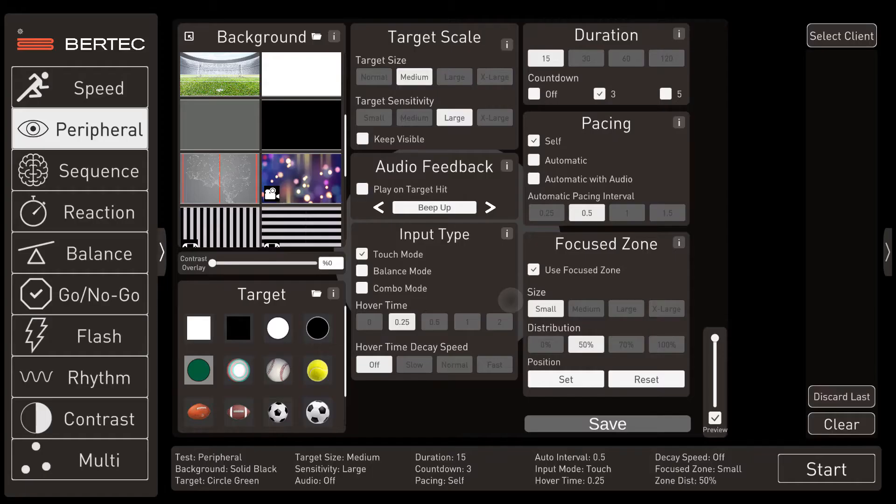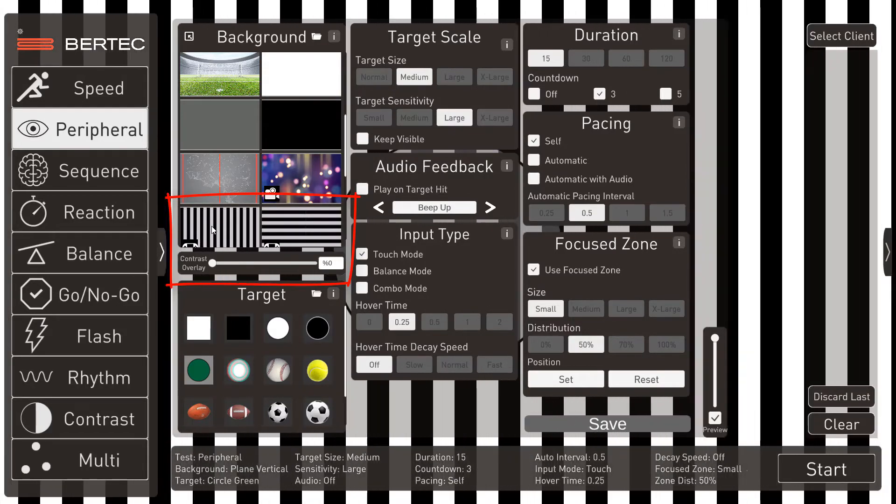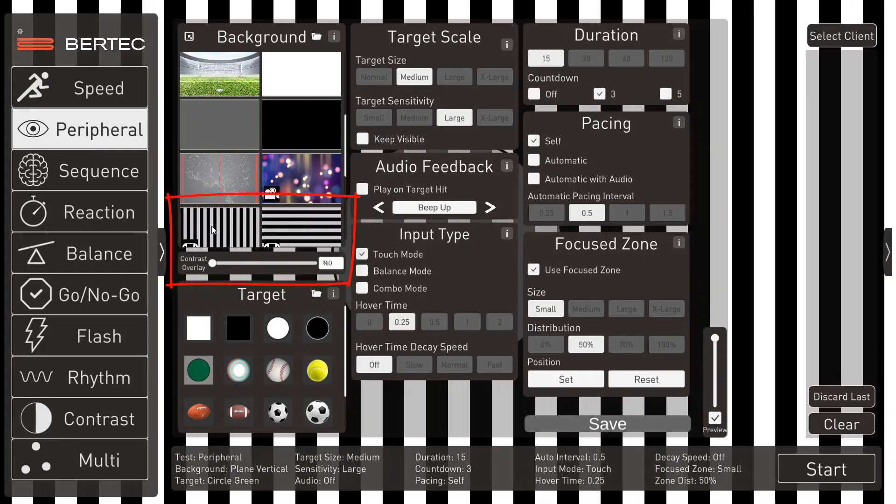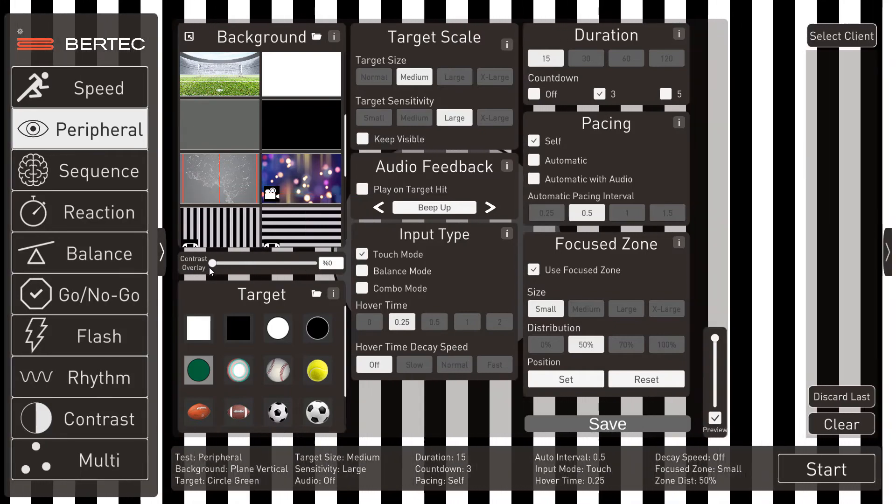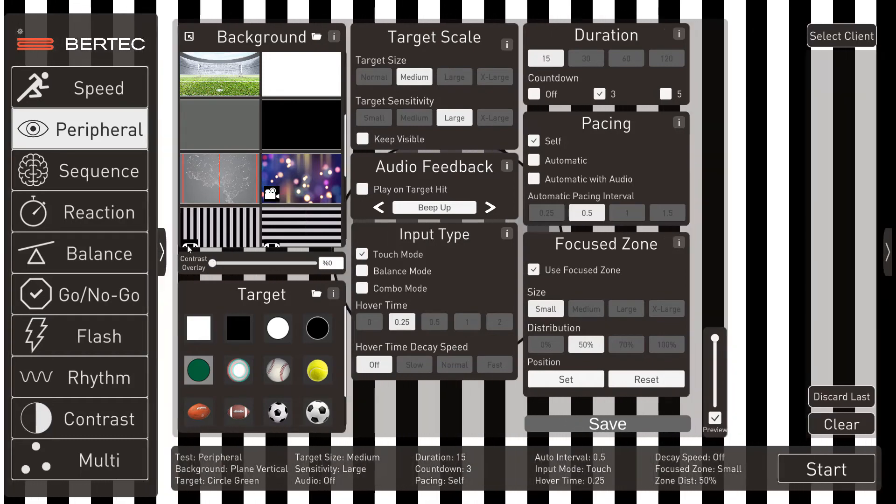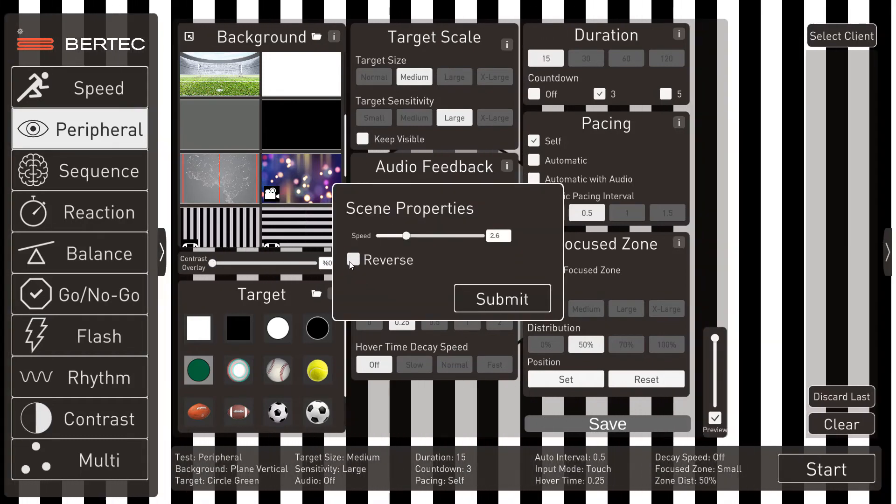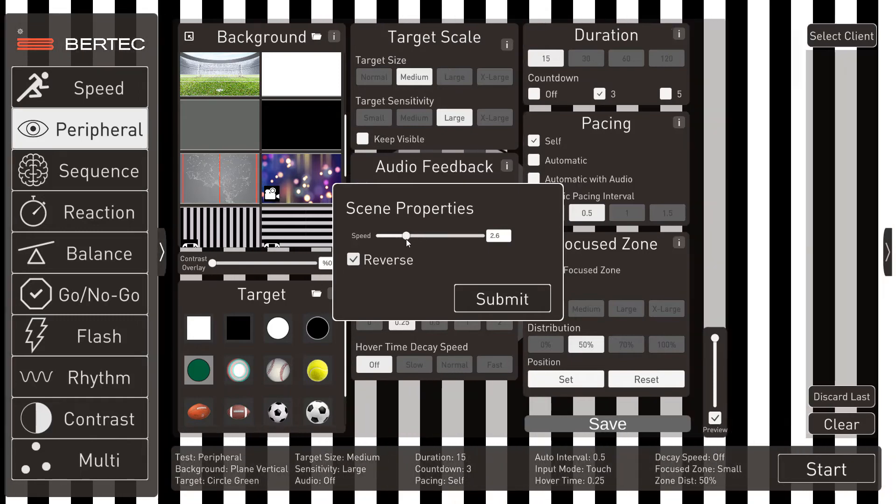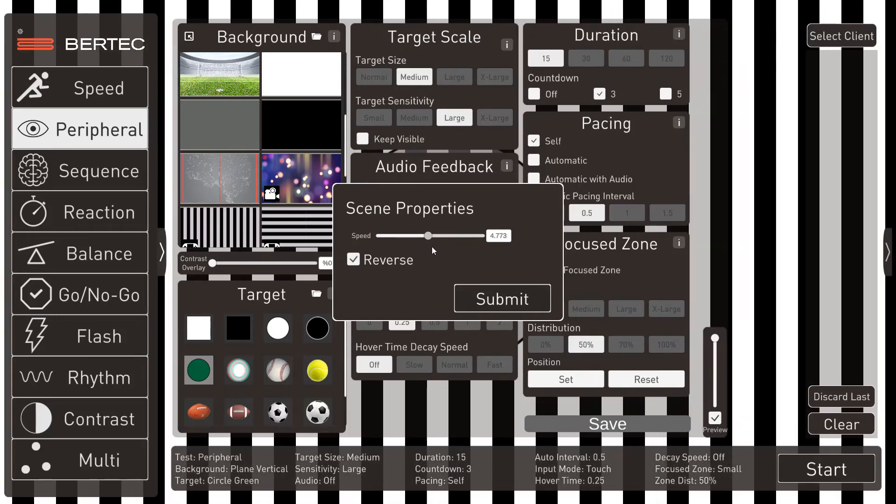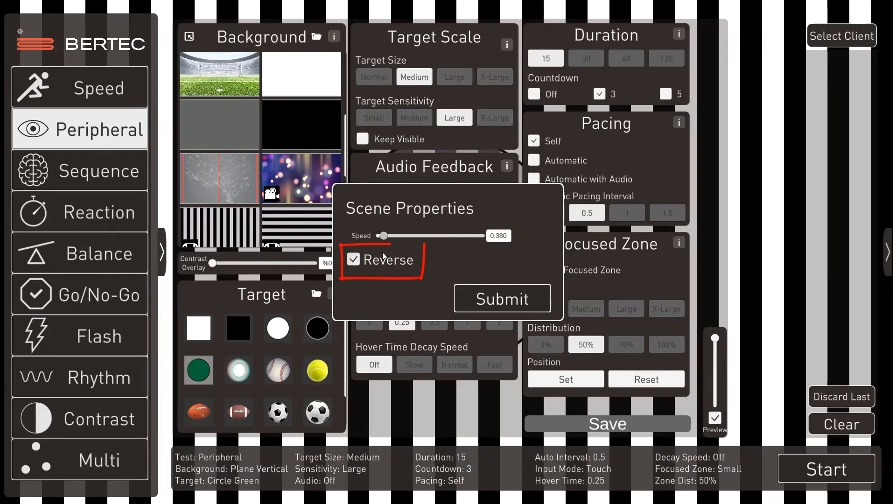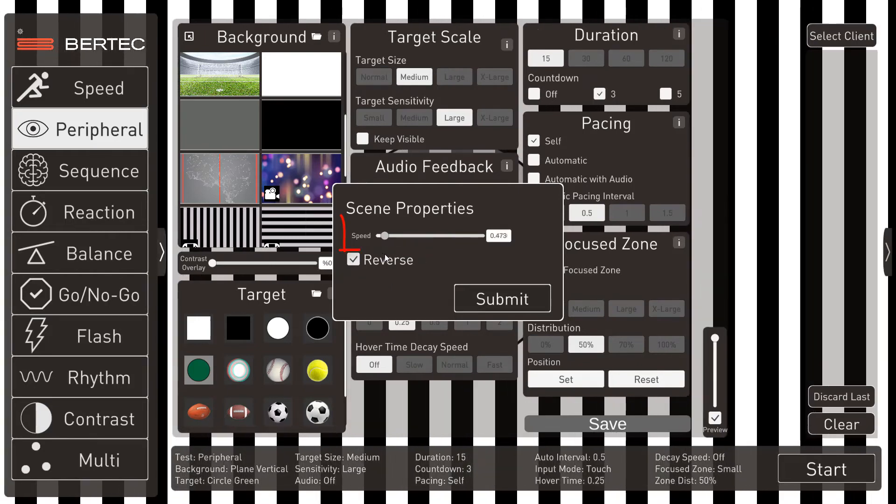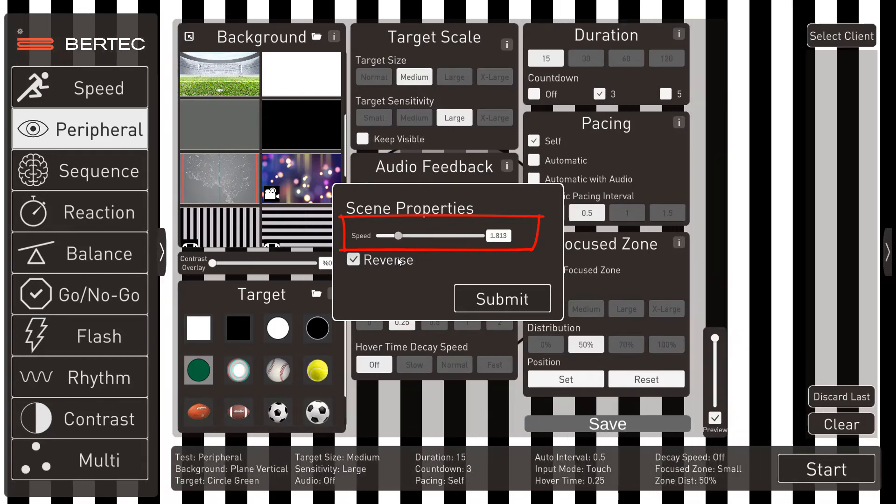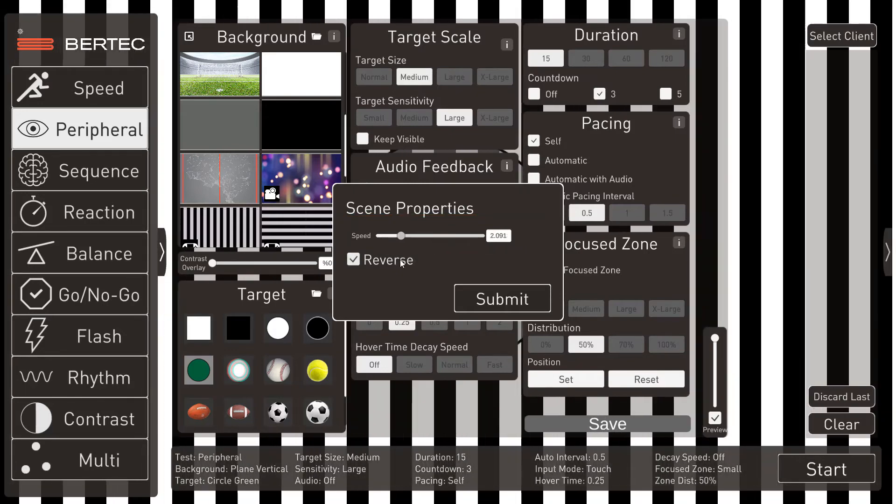Then the fun begins. We'll add a high contrast motion background to see what happens with the patient. When we add these motion backgrounds, you want to be careful that they don't fall, so you may want to use a harness depending on the patient. And of course we can change the directions and speed of the OKN stripes. Just hit the reverse button. And in another video, we'll show you how to modulate the speed instead of contrast to help the patients adapt.